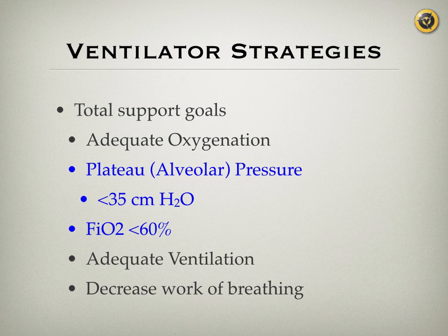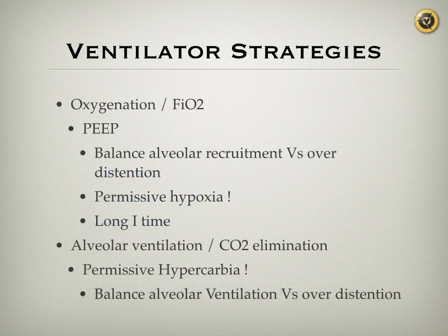So as you proceed with your strategy to ventilate your patient, if you are worried about oxygenation, then you're going to have to adjust the FiO2 to get the oxygen saturation 90% or better. You also would like to reduce shunt by recruitment, and that would be by positive end expiratory pressure, PEEP. You want to do that so you will recruit the unit but not overdistend alveoli.